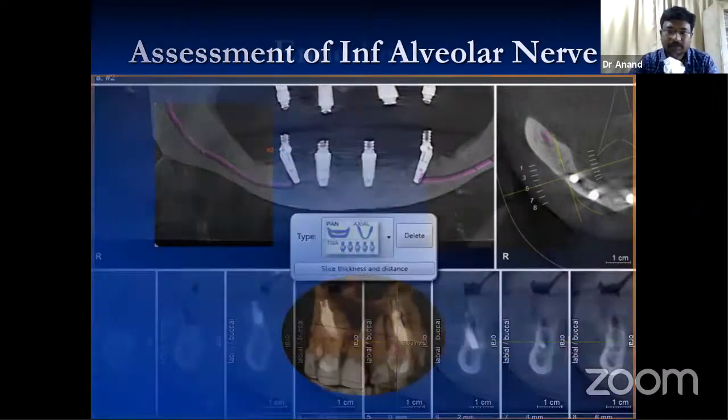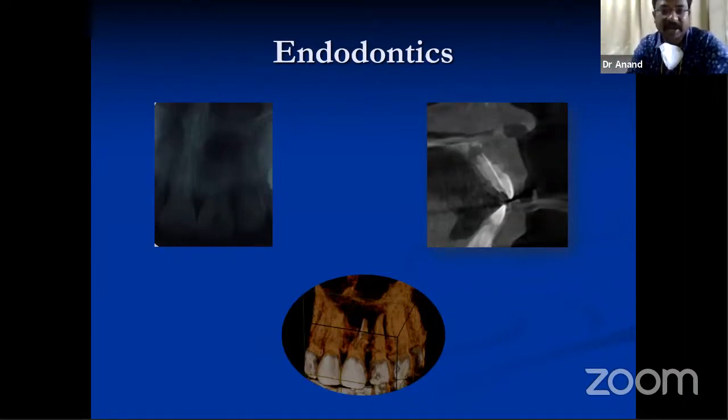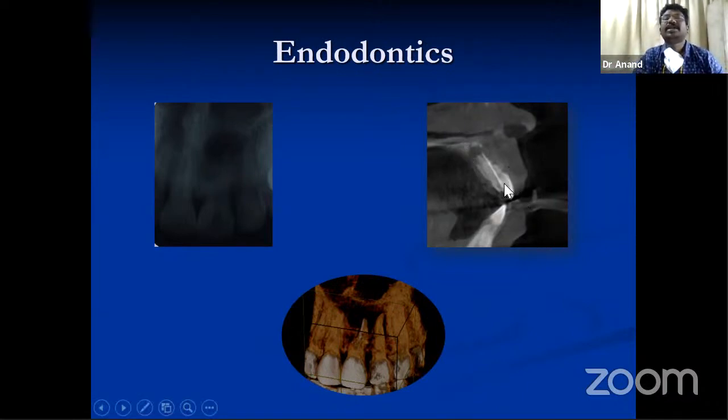And in endodontics, it is used to diagnose different additional canals. You can see perforations, external resorptions, as I said about the volume of the canals. All these things can be visualized. See, here's a GP that has been pushed along the canal and then it goes towards the apex. If you take a regular conventional radiograph, what do you think? It looks like a completely obturated canal, but it still has a pathology. But here, it gives you a guide that the GP has penetrated to the buccal surface and then gone to the apex, giving you an illusion, in the conventional radiograph, that it is present till the apex of the tooth. So, yeah, three-dimensional imaging modality is far better, not in all cases, but in cases of importance.